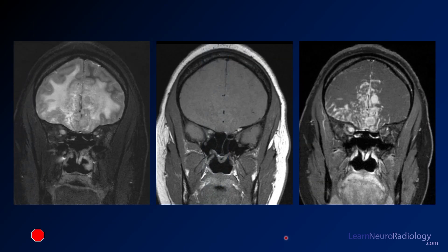On coronal images, the right optic nerve is swollen and T2 bright with nodular areas. Comparing pre- and post-contrast images, you see nodular areas of enhancement — some in the leptomeninges and some appearing to be in the parenchyma.